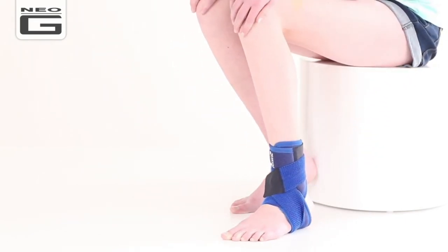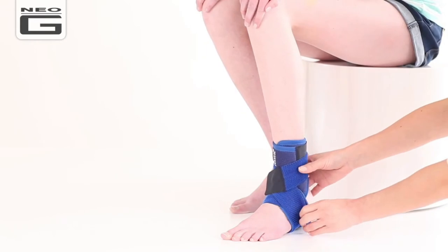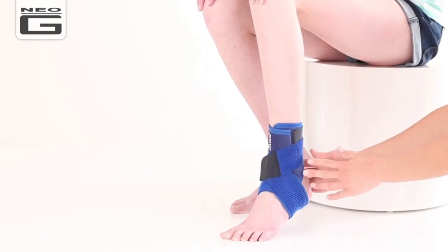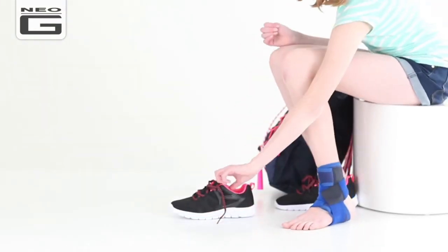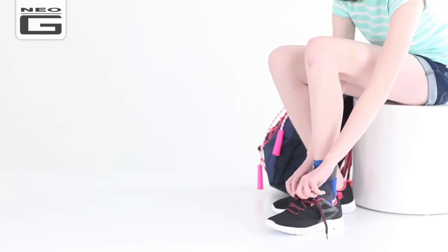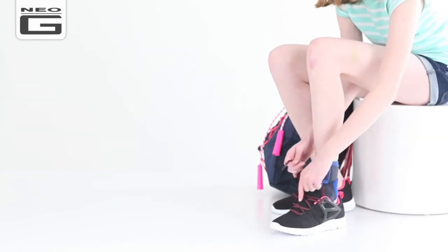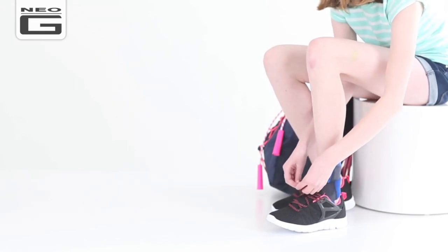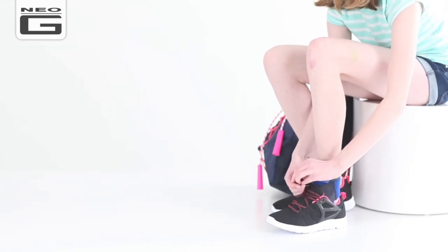Adult assistance and supervision is recommended to check the support has been applied correctly. Neo-G Kids Ankle Support with Figure of 8 Strap fits easily into most shoes, and be it during recreational or sporting activities, the support is perfect for rehabilitation and helping reduce the likelihood of re-injury, giving your kids reassurance when they need it most.